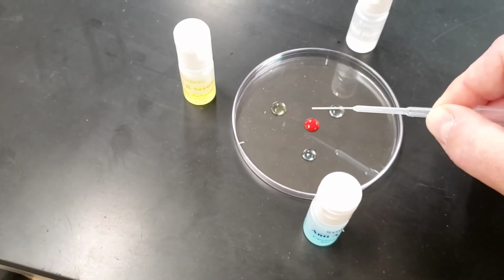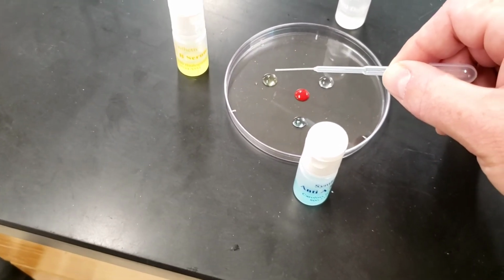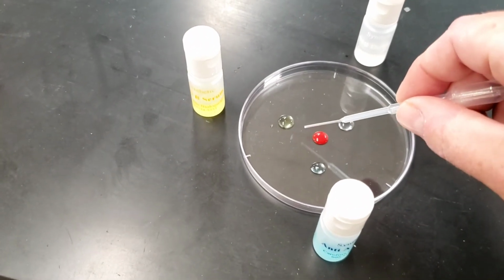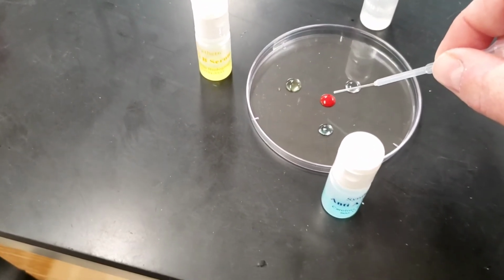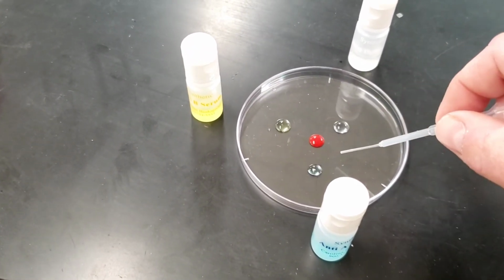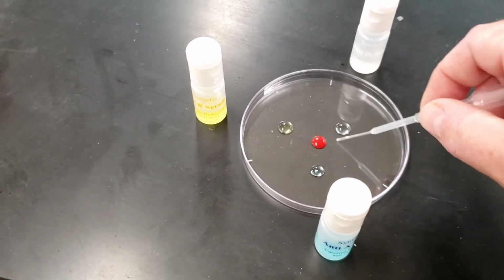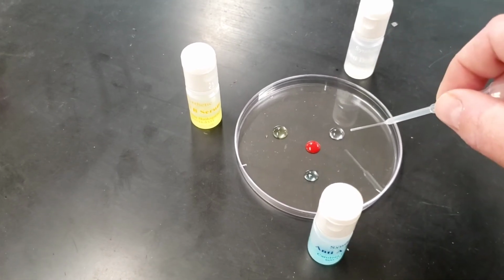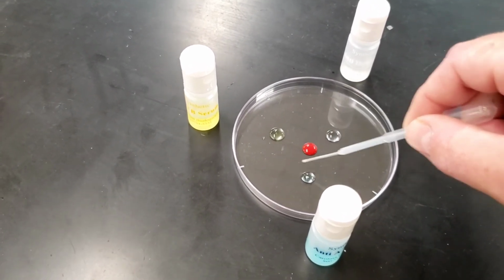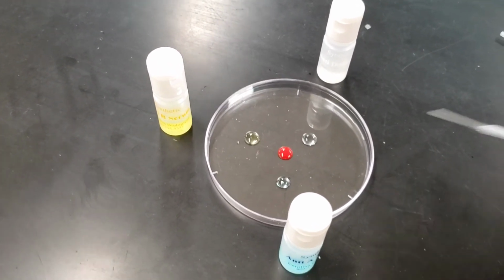So if the band only formed between the blood and the anti-B, then it must be type B blood. If it formed only between the blood type and A, then it must be A blood. If you got a band to form in both places, then it's AB blood. If it formed in all 3 places, so there, and there, then you would have AB positive blood. If it formed nowhere, so no bands anywhere, you'd have O negative blood. And that's how you should read those.